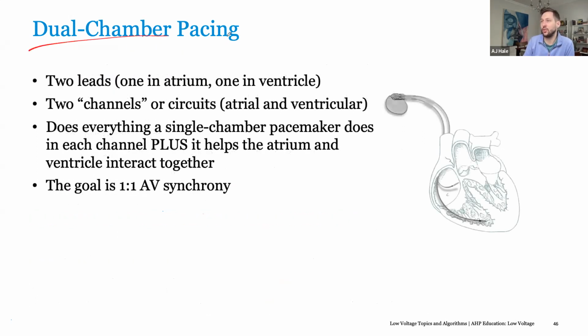We will get into dual chamber pacing on a different day, because Lord knows I've already talked long enough for y'all and you probably need a break. But the idea with dual chamber pacing, just keep in mind there's 2 cycles, there's 2 channels we're having to deal with, and we'll go through all that.